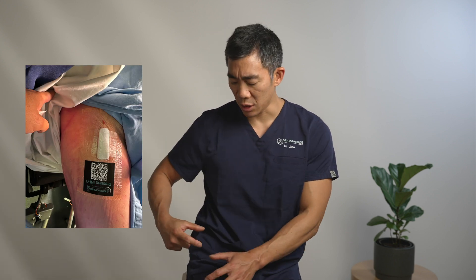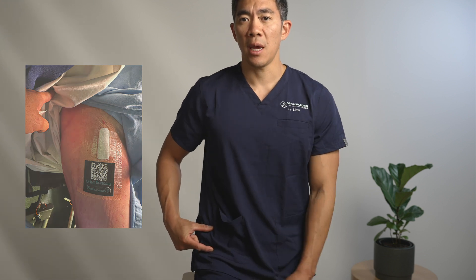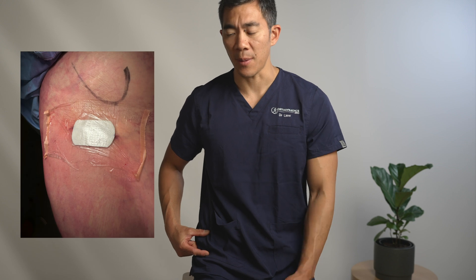For a hip replacement with the direct anterior approach there are two main incision directions. The main, more traditional incision is just here on the front of the hip. The bikini line incision, which we perform for some of our female patients, is at this angle here, approximately 90 degrees to the standard incision. Both incisions are approximately 5 to 7 centimeters in length, depending on the size of the patient and the size of the bone underneath.